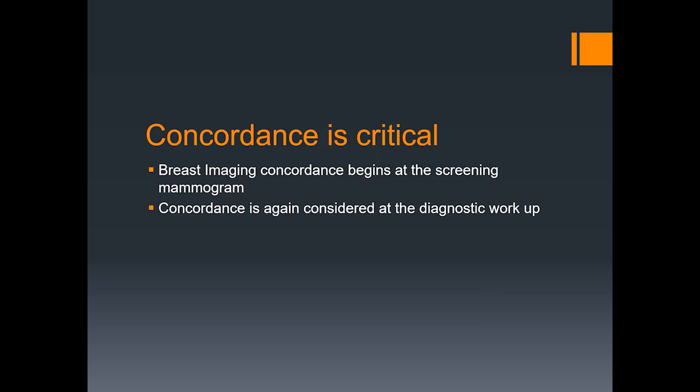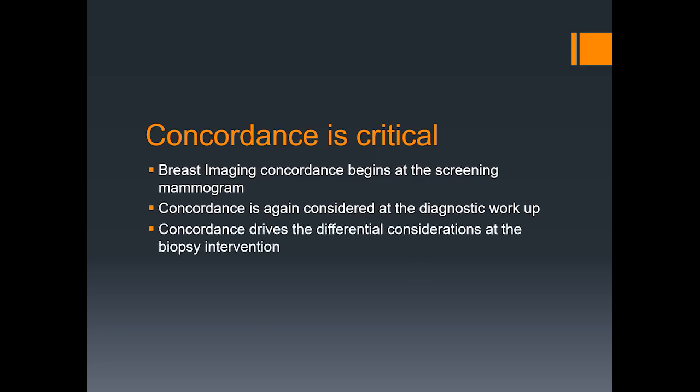Concordance is again considered at the diagnostic workup. We're always taught in thinking about BI-RADS codes to think about the patient in a fresh perspective at each setting. So when she returns for her diagnostic additional views, concordance is again considered. What did we see on screening mammography? How will we work this up? And what modalities will we use? So we drive our differential considerations at the biopsy intervention as well as the diagnostic imaging.